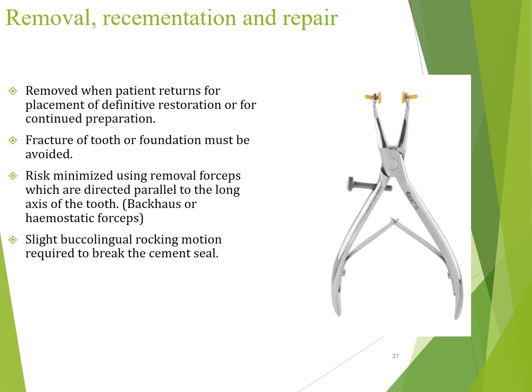So the tooth should not fracture off. So you can use a forceps, and that is known as the Backhaus or hemostatic forceps to remove it. Also, there's slight buccolingual rocking movement which is required to break the cement seal. So it's just the movement of the forceps which can be used, or either you can just take it out with a probe.